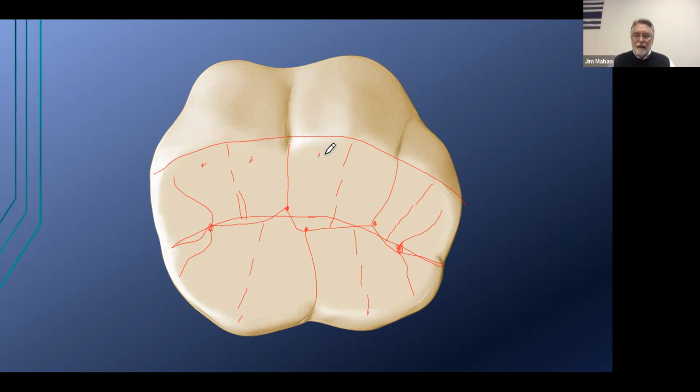Now, I don't have to go back and do this. If you're training this, you'll want to do that. But typically, on maybe the 10th try, you can say, I know where the middle of that goes. It's right there. Middle of this goes right there. Right here. Right here.